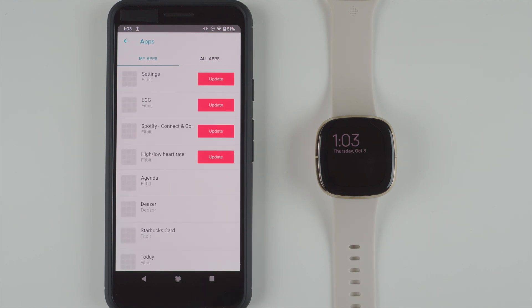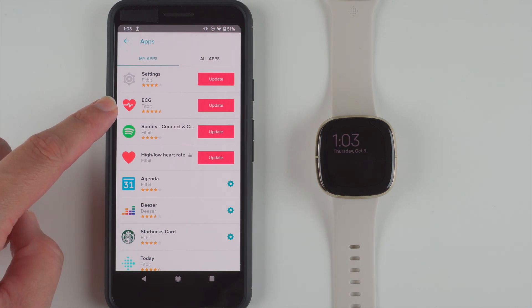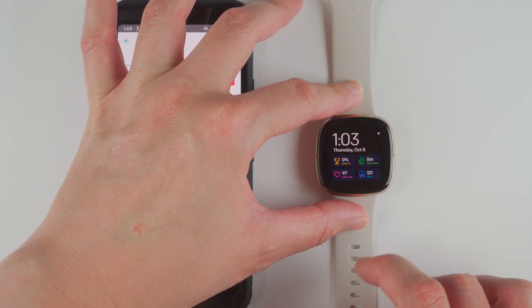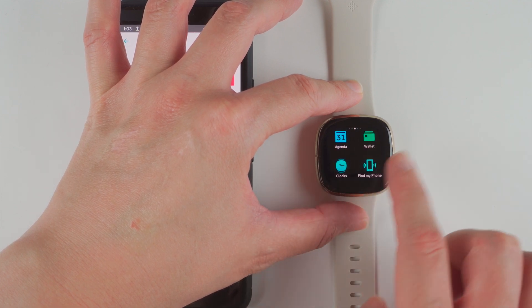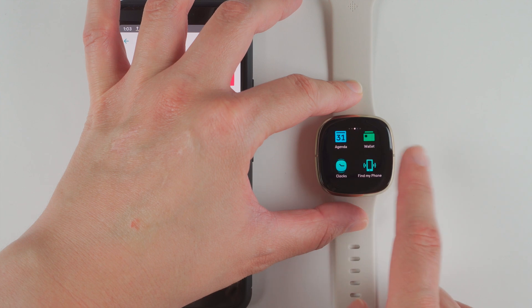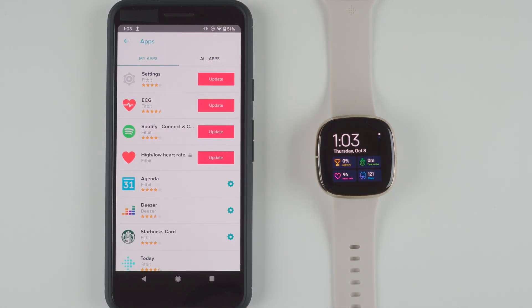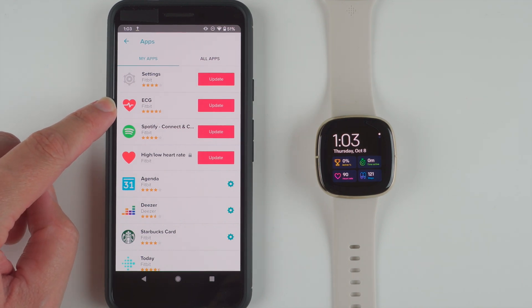It's going to show you the apps that are currently installed, and it looks like it does have the ECG app installed — which I didn't think was the case earlier. Let me verify. I'll wake up my Sense and swipe and see. I don't see it in my list of apps, so I think it's just showing that it's available. So I'm going to go ahead and tap on Update on this little ECG row.